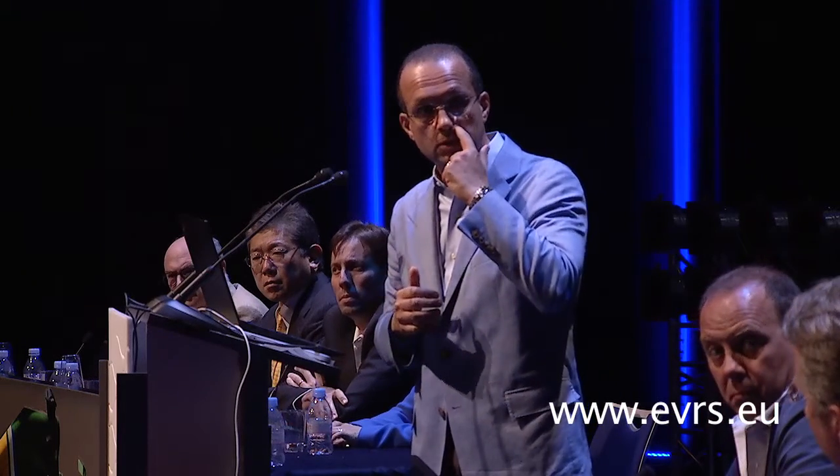Carsten, how do you peel those? I would perform it in a similar procedure, that you try in the middle of the traction, that you open the retina, you go into the subretinal space, you cut it, so that you don't have to open it at too many spaces. I do it bimanually, so that you can also secure the retina a little bit, so that the retina is not enlarging, because by pulling sometimes they can be very tense. And when they're really in the periphery, sometimes if you remove them by traction, some ends remain somewhere in the periphery. They don't exert any more traction on the retina, so they can remain as little particles in the subretinal space.